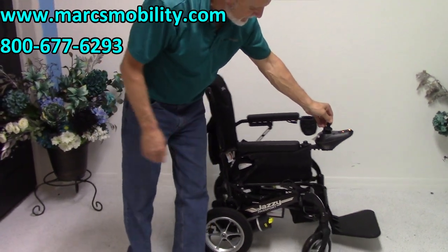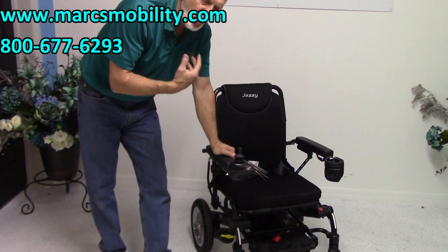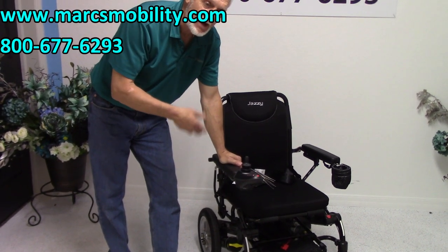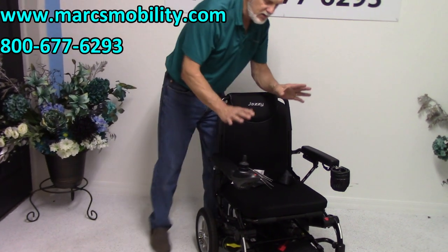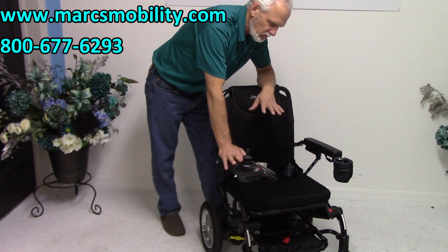This chair has a weight capacity of 250 pounds. A lot of people call me and they're above 250 — at 280 or 290 — and I would not recommend this chair for them. We only carry the Passport because it fits most people; it's the only model we carry.